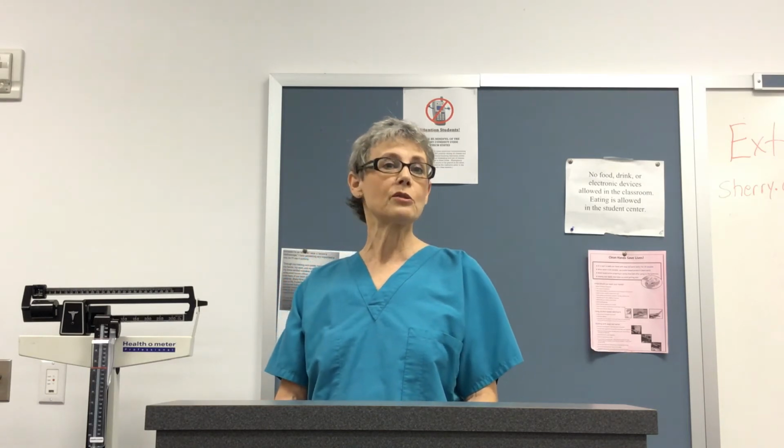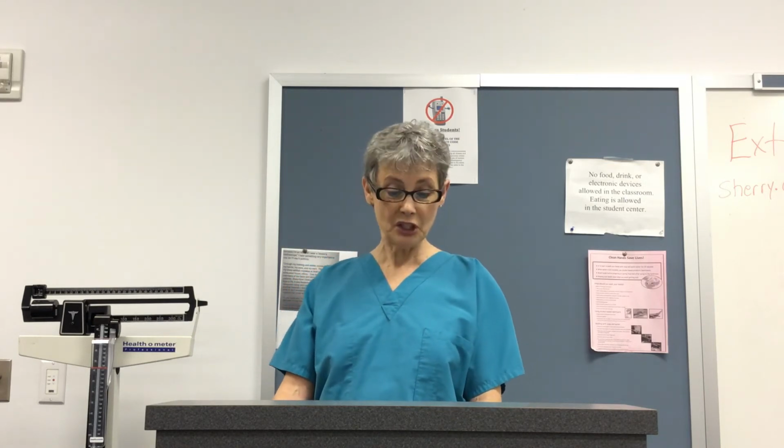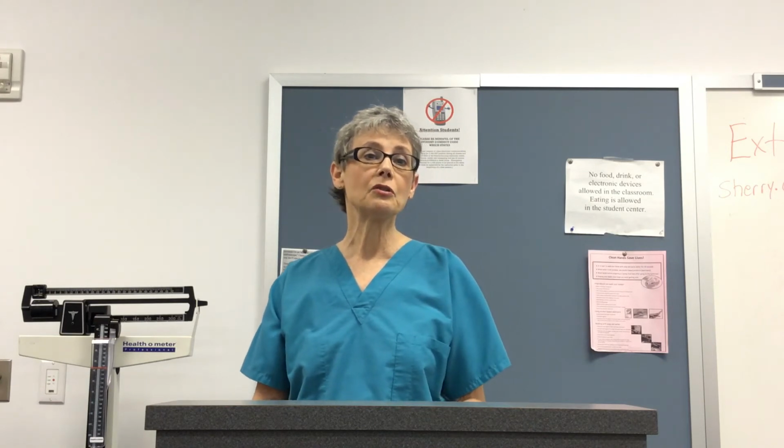Infection. Of course, we definitely want to decrease our risk of infection. You may see purulent drainage, some redness or edema at the site, and the patient may have fever and chills, and you would definitely want to remove the IV. It may still be running just fine, very patent, but if it has signs and symptoms of an infection, you must take it out. No matter if it took you 3 hours to finally get one in, you have to take it out and notify the physician.